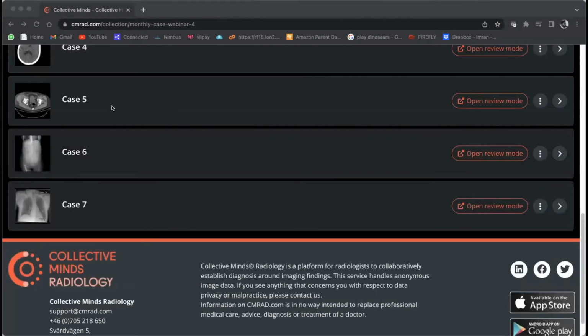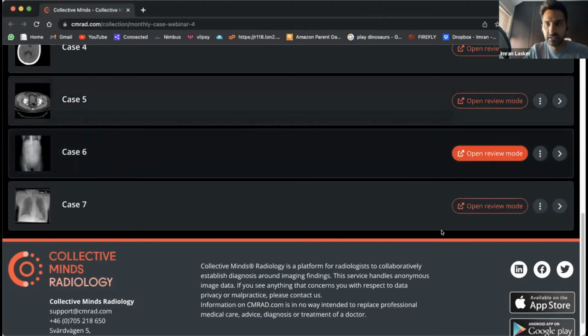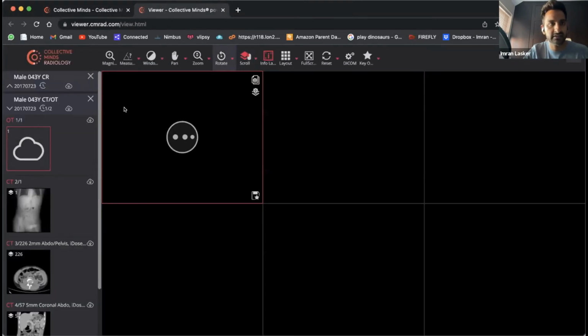So yeah. In the chat, Imran. Oh yeah, they said I've answered that. Oh yeah, there's a stercoral colitis, and I've said that's true. So I'm going to say I'll answer that live. Done. So fine. So yeah, well done. Whoever's picked that up, very good. Let's go to the next case.